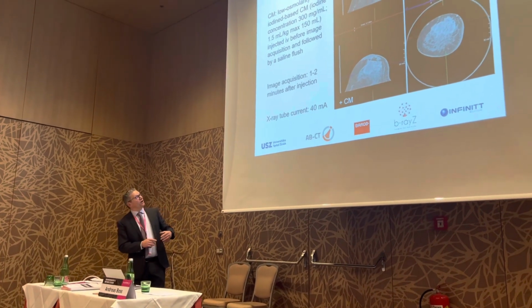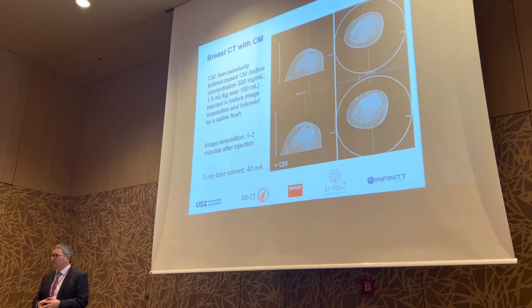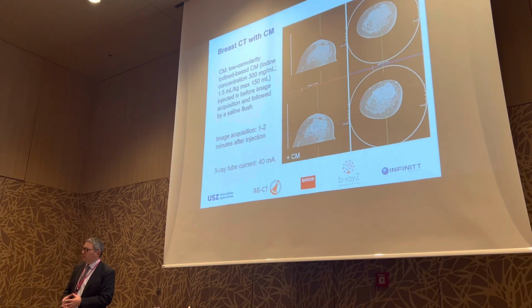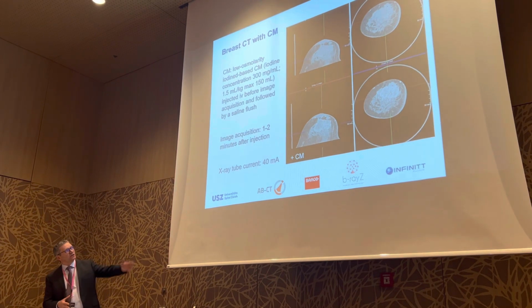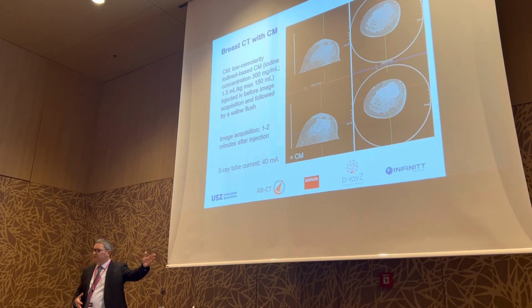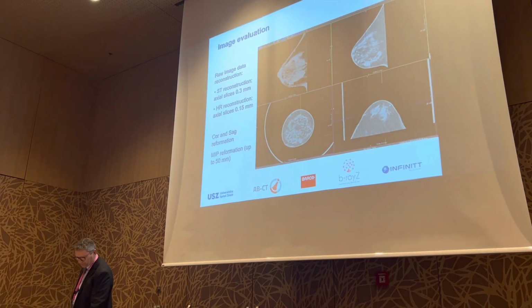So, of course, what you also can do, we mostly use it non-enhanced, so native images for screening purposes. In these patients, I don't want to give iodinated contrast agent, but if there is a problem to solve, let's say there is a clinical question, there is no problem with applying contrast agent, and of course you then get excellent images of, for example, breast cancer. And this is, for example, one of the cases that you can see on the PACS system, and you can appreciate the high quality of the depiction of the breast cancer if you use iodinated contrast agent.